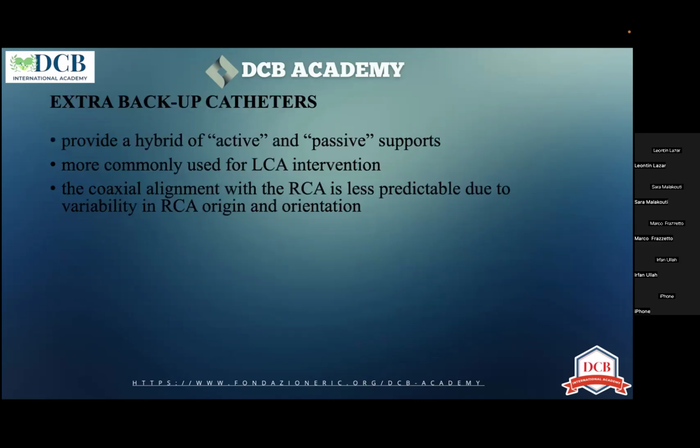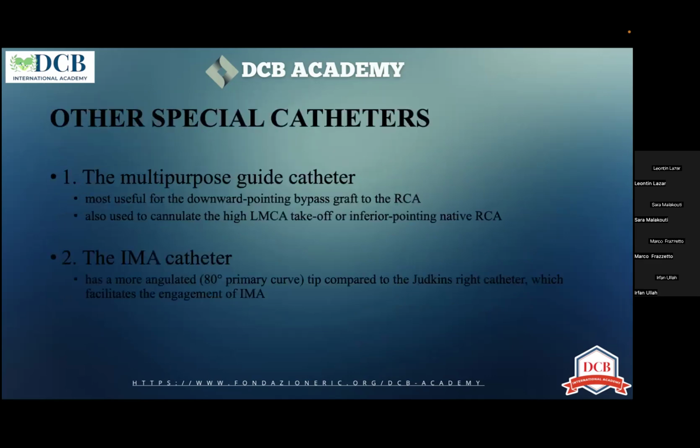The extra backup catheters provide both active and passive support. They are more commonly used for left coronary artery interventions. They can be used for right coronary arteries, but they are less predictable and they can go very deep into the coronary, so I wouldn't recommend it.